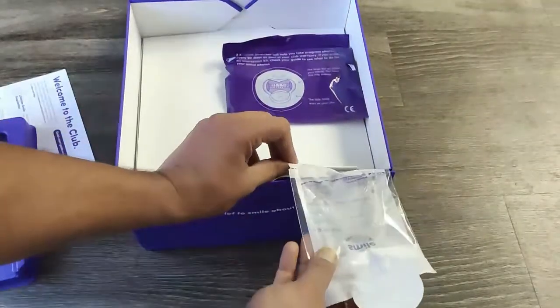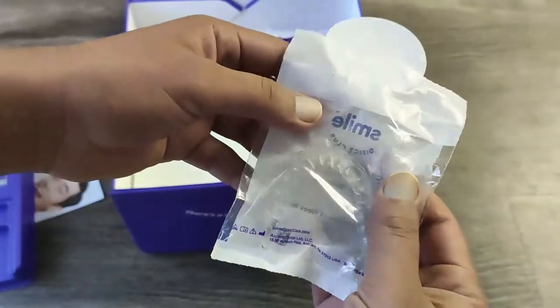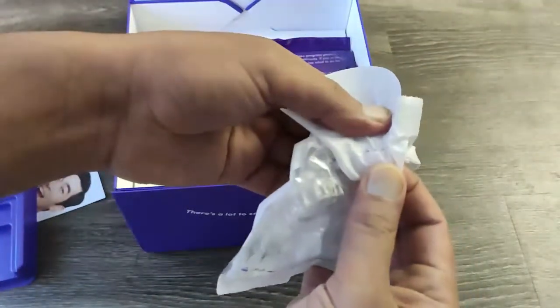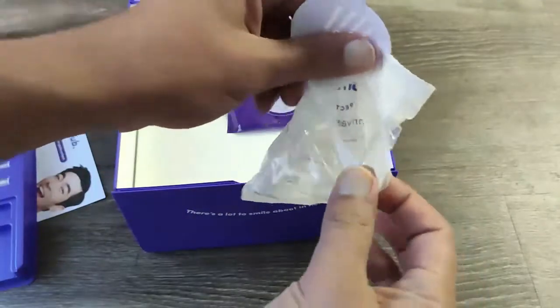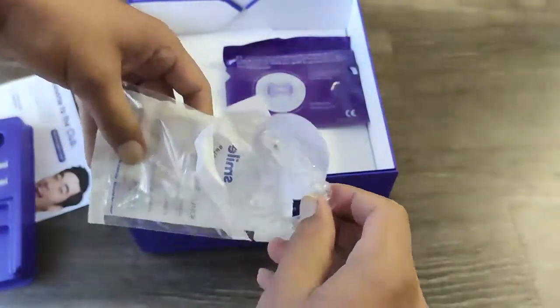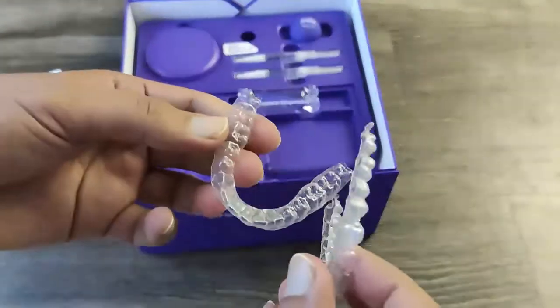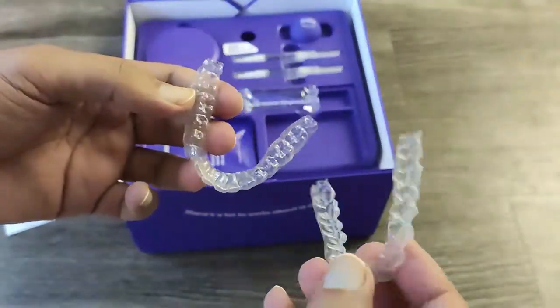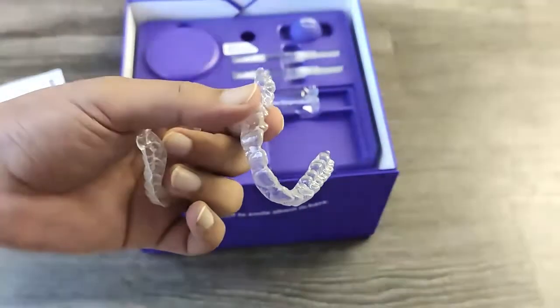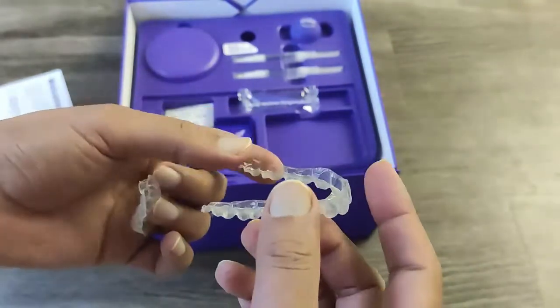After receiving the full package, within two days you'll receive a call from SmileDirectClub customer care, and they will explain everything. During that induction call they explained everything to me and gave instructions on how to put on my first aligners. They also told me that if the aligners don't fit well, I should use the filing emery board — as shown in my instruction screenshot — to file them so they don't harm or make my gums bleed.